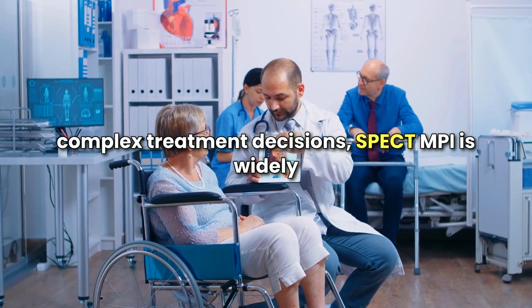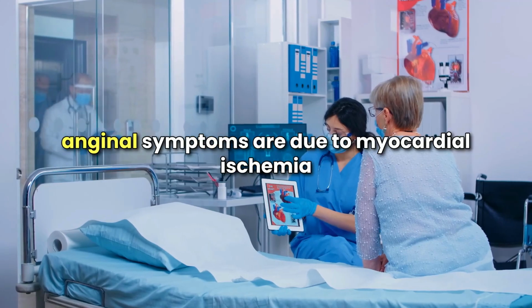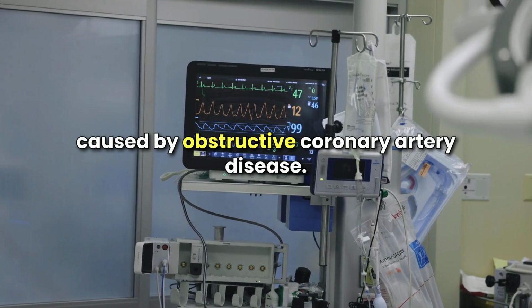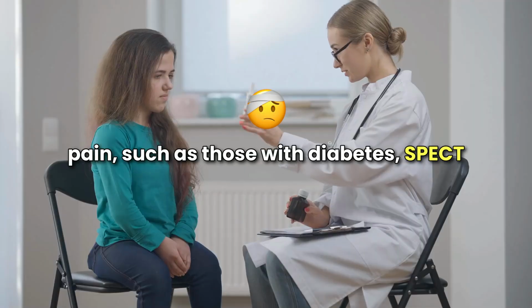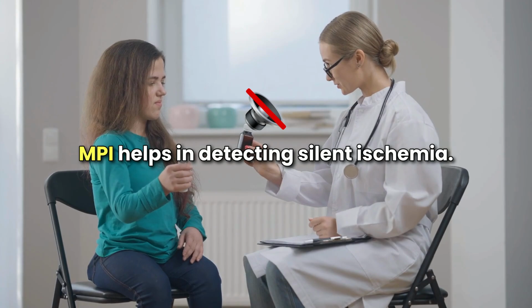SPECT MPI is widely used to determine if chest pain or anginal symptoms are due to myocardial ischemia caused by obstructive coronary artery disease. For patients who don't experience typical chest pain, such as those with diabetes, SPECT MPI helps in detecting silent ischemia.